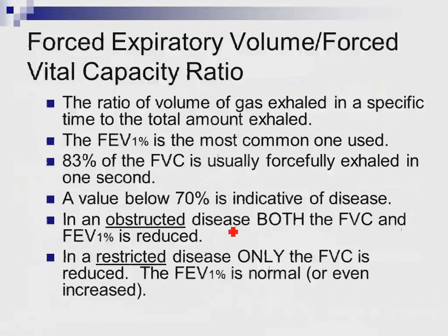I can then compare that FEV1 to the FVC. We're going to call this the FEV1%.